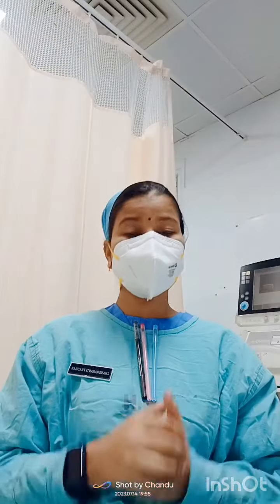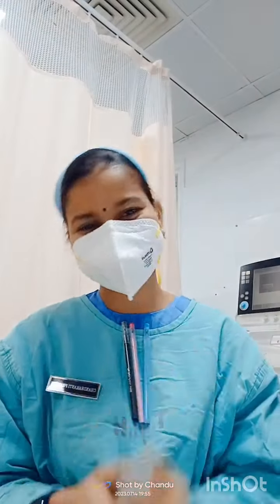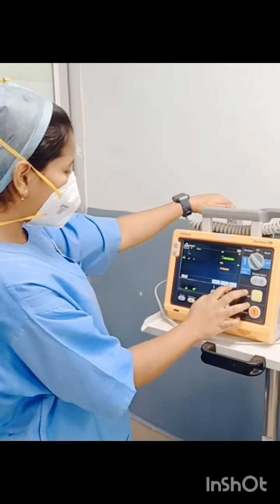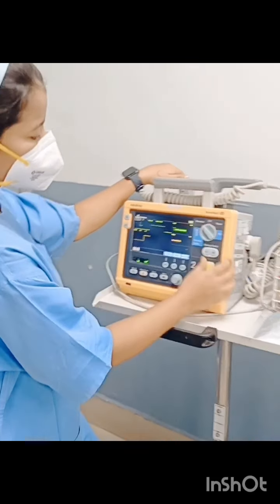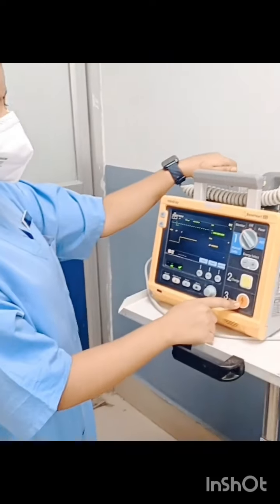Then I will show the parts of the defibrillator. Come with me and I will show which are the parts, how they work and how it is used to provide electrical energy or shock to the patient. Now see the parts of the defibrillator. There is a monitor screen and a pacer, the setting for the automatic external defibrillator and the manual defibrillator. There is an energy selection, this is the charge button and this is the shock button.